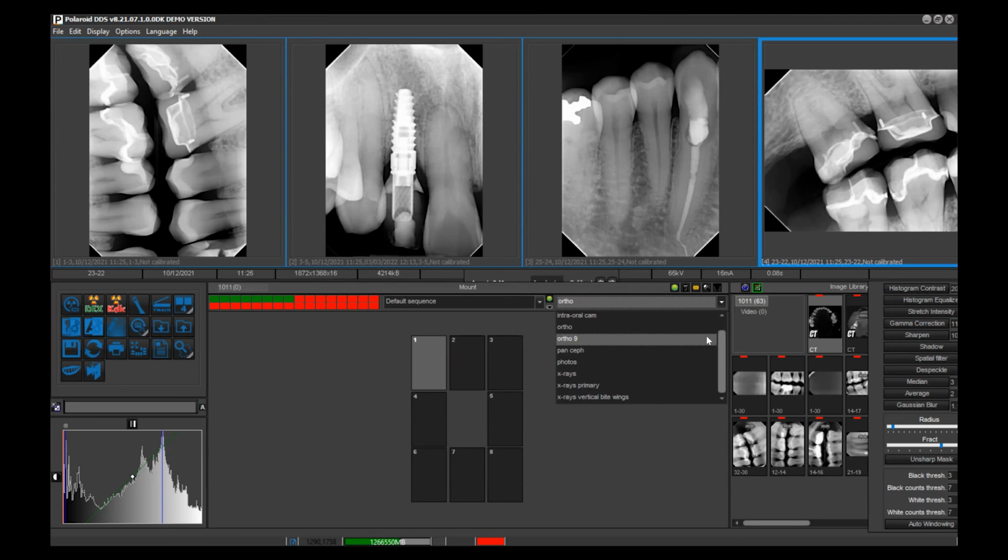We actually just use an iPhone now. We bought 2 iPhones because the cameras are so good on them, and I have some bridge that literally you take a picture on the phone and it just throws it into the patient's chart. It works beautifully. There you go. Okay, there you go. Yep.